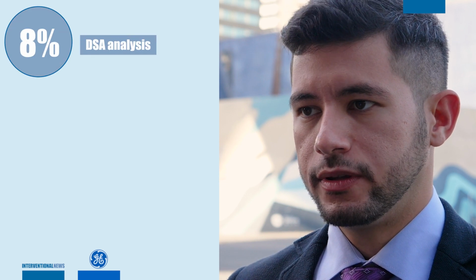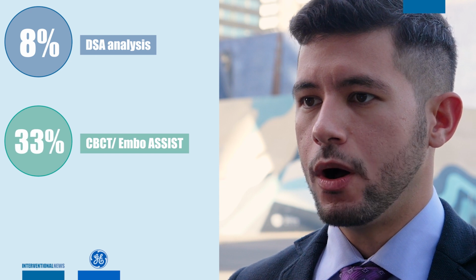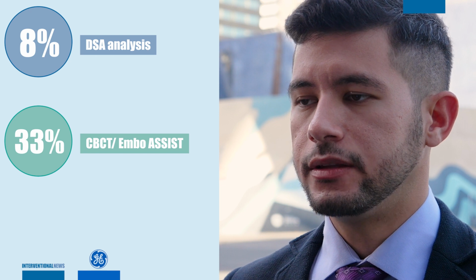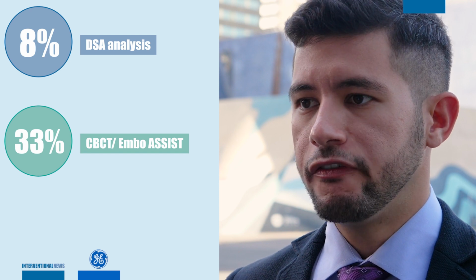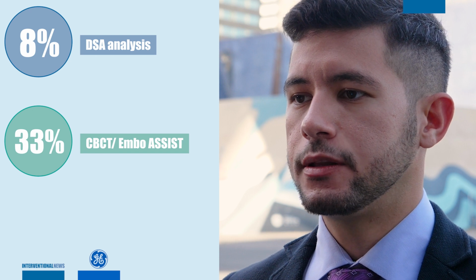However, and that's important, almost 1/3 of the hemipelvis analyzed had at least one secondary prostatic branch, which is significantly higher than the 8% previously identified on DSA alone. So based on CBCT, we found almost 4 times more secondary arteries than previously described, based on DSA only, which are important to embolize to reduce the incidence of revascularization, and we believe to reduce LUTS symptoms recurrence after PAE.